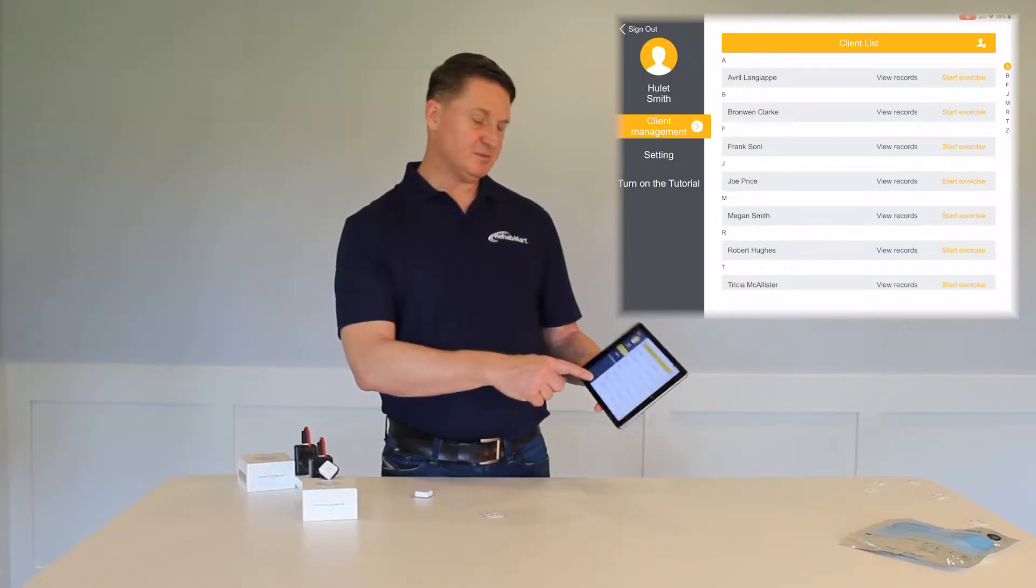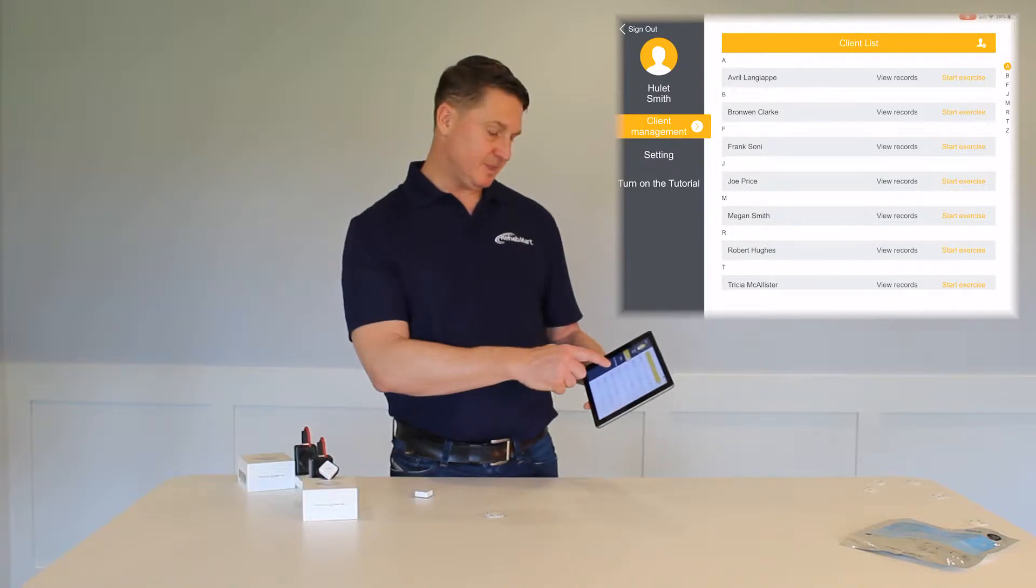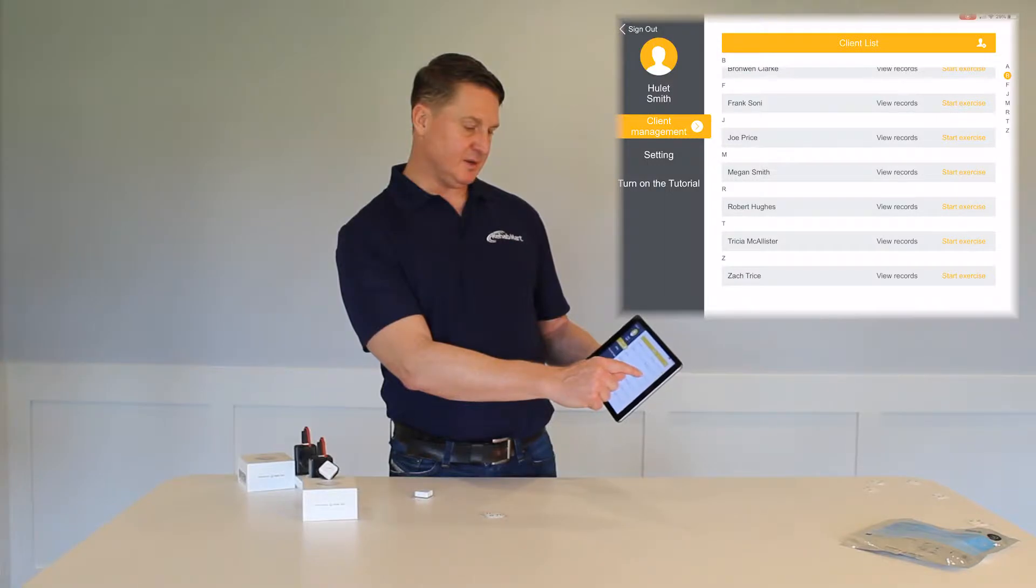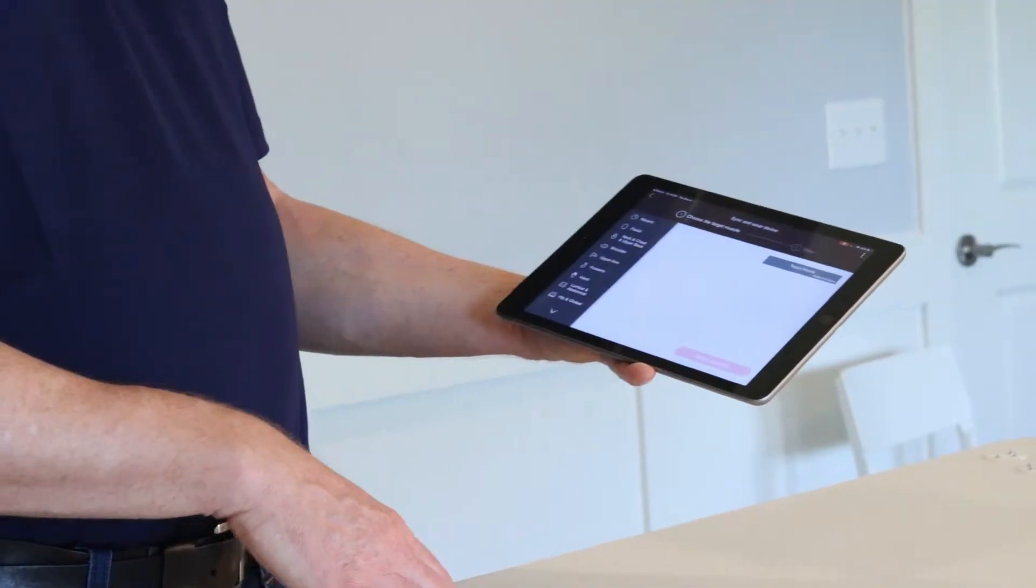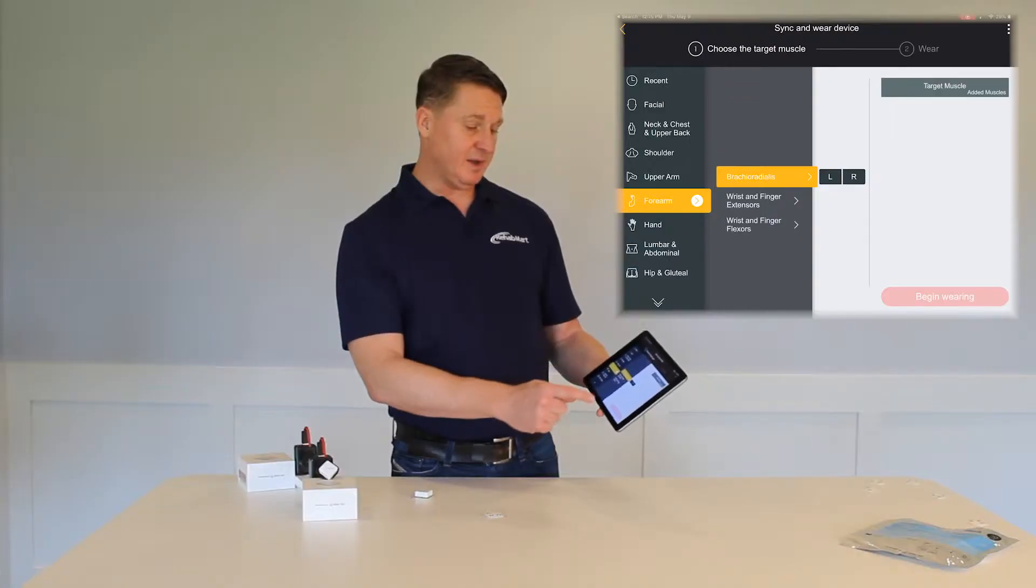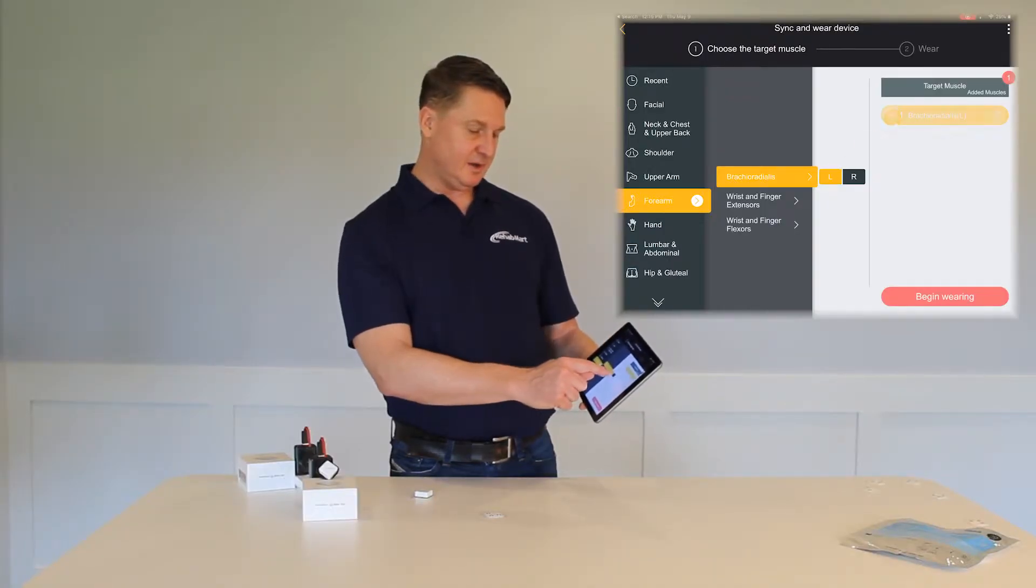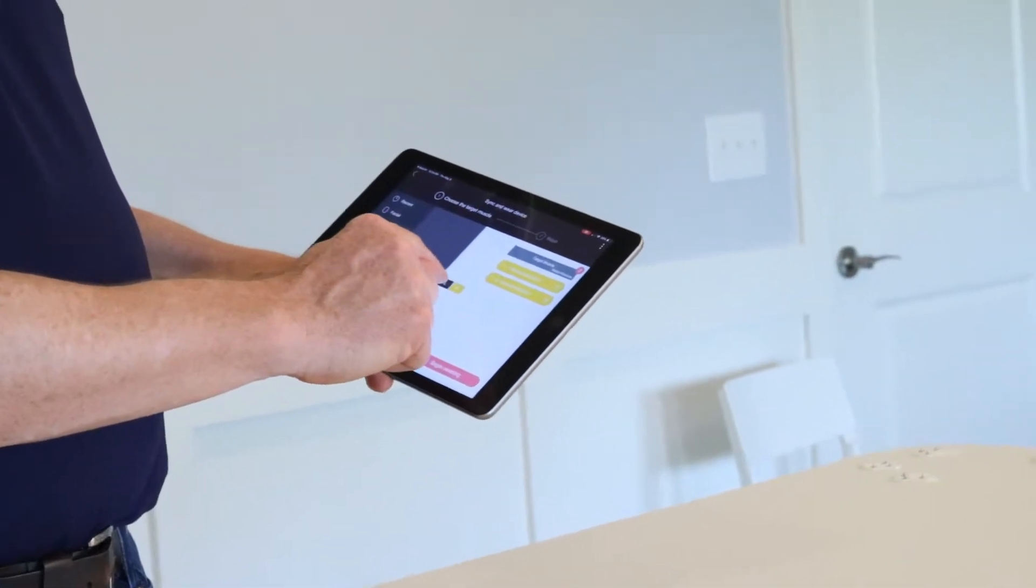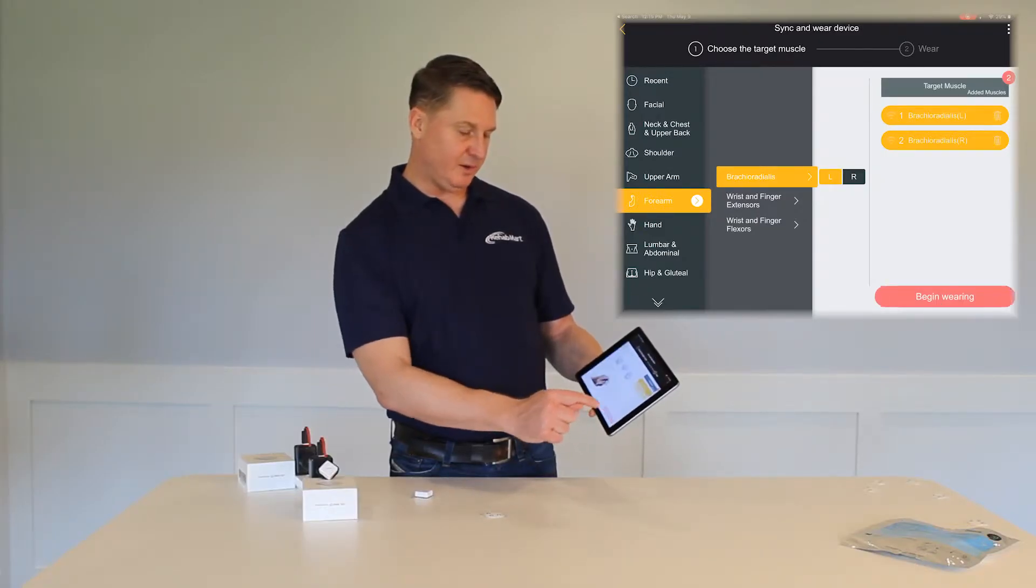For this section, I'm just going to pick a sample patient, Joe Price. This is a made-up patient. We're going to go beside Joe's name and click start exercise. I'm going to go down to forearm and choose brachioradialis. I'm going to choose left and right, and then activate left and click begin wearing.